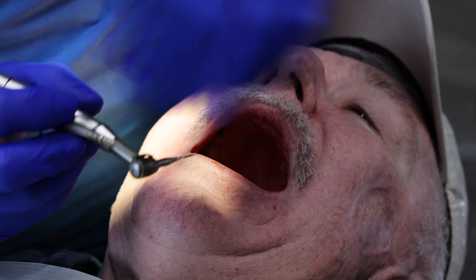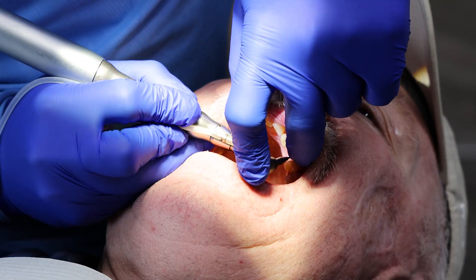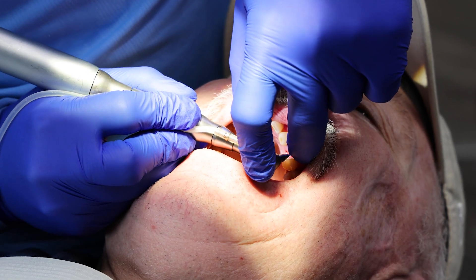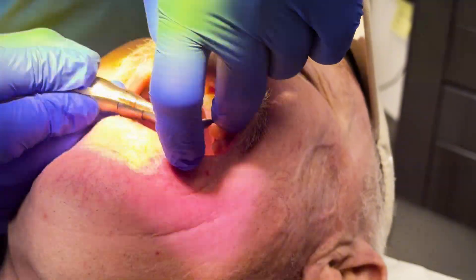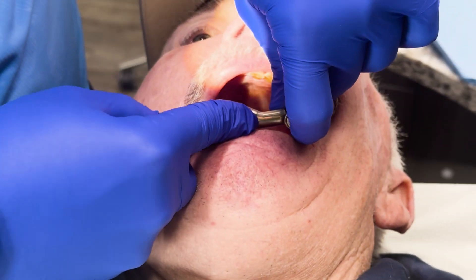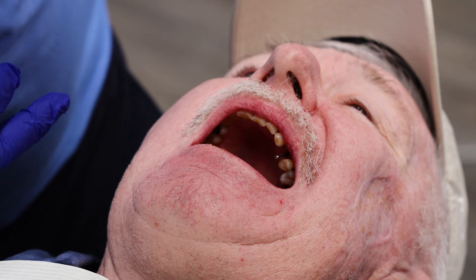This is going to be very important in terms of tactile sensation because that extraction site still has a little bit of bone to fill in. So what I'm going to do is put the pilot drill in until I feel the solid bone. I haven't even started the motor yet — I'm just getting that tactile feel of solid bone. I'm going to angle it a little more towards the palate because that's where you get the densest bone in this situation. I left the pilot drill in there to show you guys the angle where I did the pilot drill.